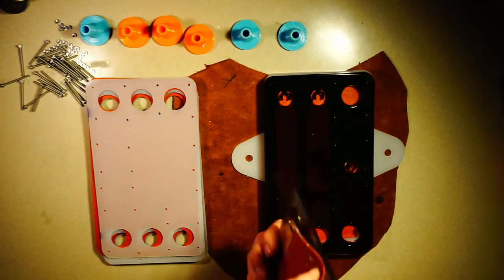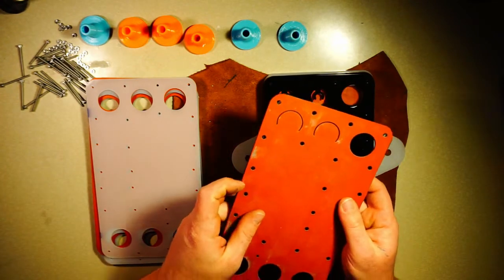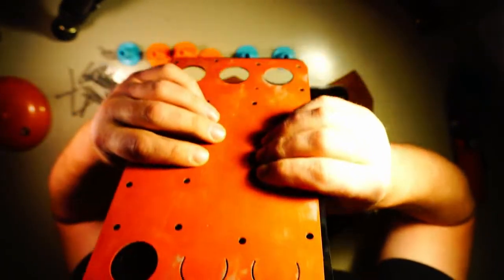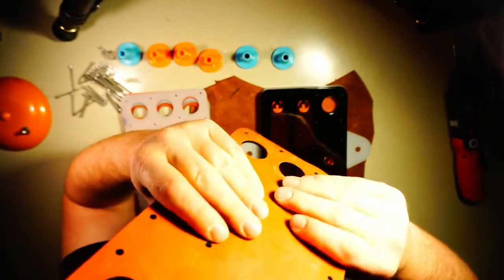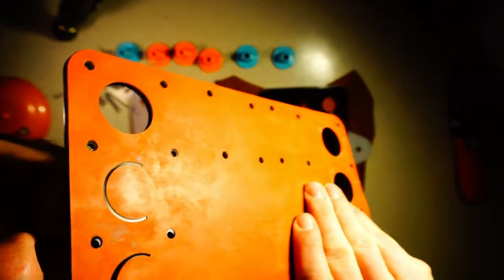So for example, let's do this. Let's see if I can get my face in here. If these are aligned, you can blow through but not suck through one of these ports.